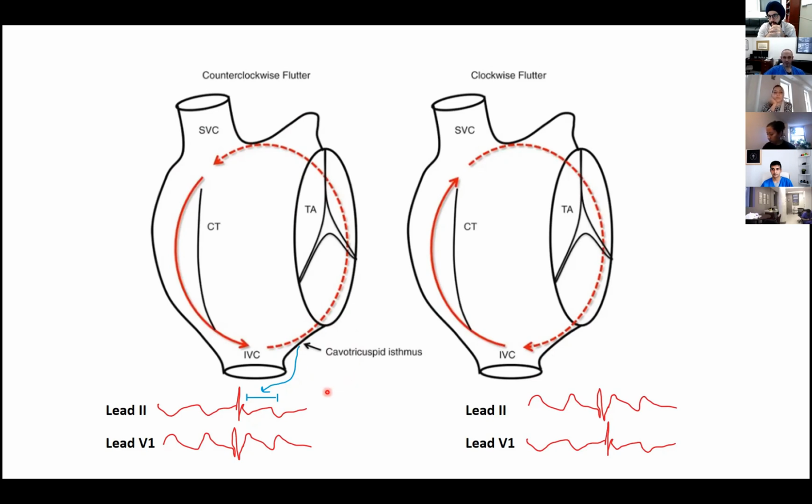In some electrophysiology textbooks, flutter is actually referred to as an atrial tachycardia, just with a macro-reentry circuit. So it's really a spectrum of conditions. The reason the sawtooth pattern is formed is this slowing of the impulse during a certain part of the circuit in the right atrium. Then when the fast depolarization happens, you have a negative or positive deflection that determines whether you're dealing with a counterclockwise or clockwise flutter. These are called typical flutter, and they are the vast majority of flutters.